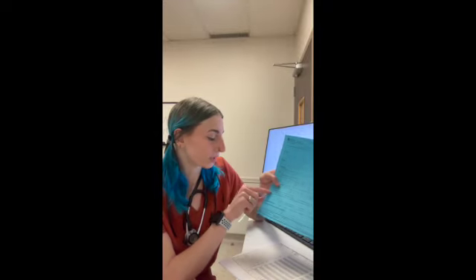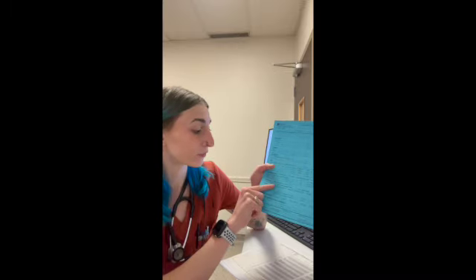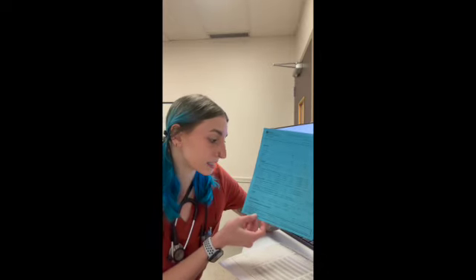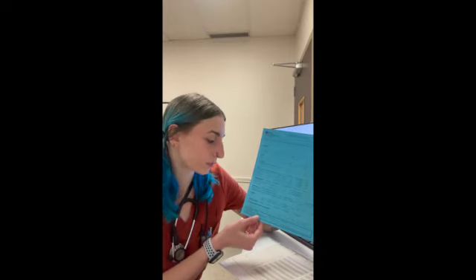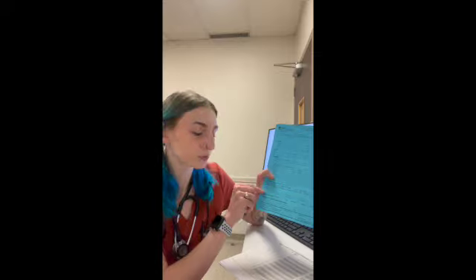And then we also are going to go ahead and calculate our maintenance anesthetic gas rate that we want during our procedure. We're going to calculate and determine our flow rate for the first 15 minutes and then throughout the procedure. Our tidal volume, we're going to determine our ET tube size, what size circuit we need, and what size breathing system we're going to want, and then also the reservoir bag size. And then once that has been determined, we're going to calculate the IV fluids that we want throughout our procedure and put them at the bottom.